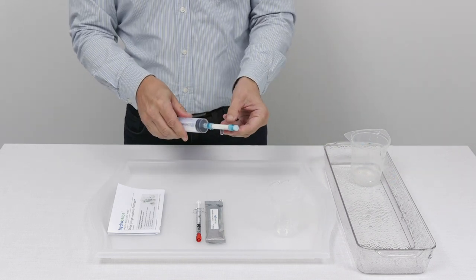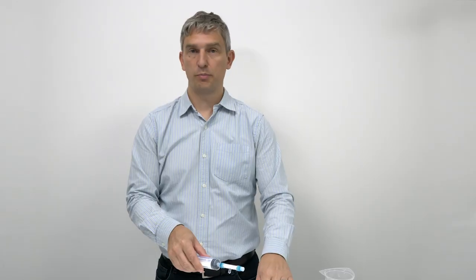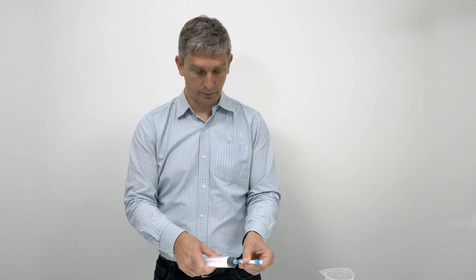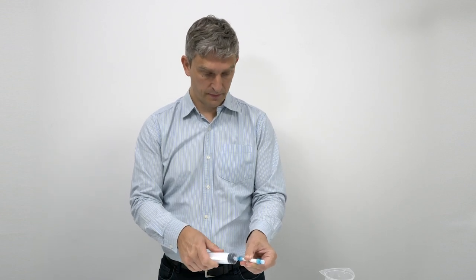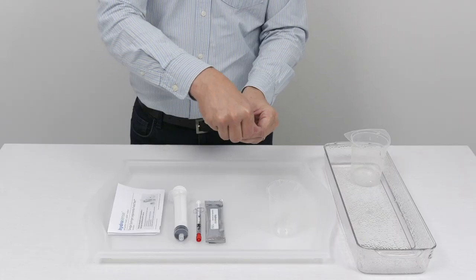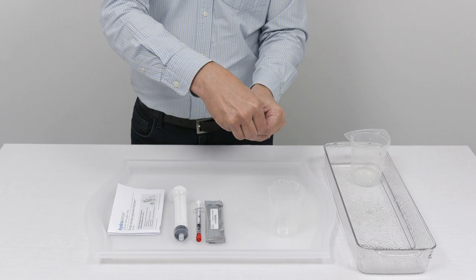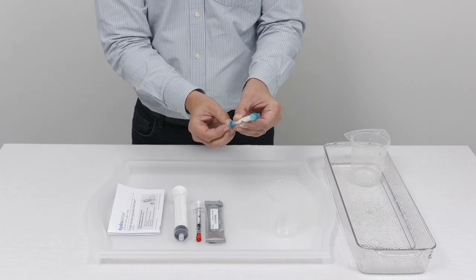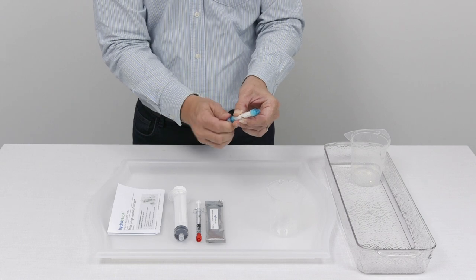So now that we've concentrated any Legionella bacteria that were present in the sample into the filter we need to extract them from the filter. The pressure from the syringe has been pushing the bacteria up to the top end of this filter here so in order to increase the sensitivity of the test we recommend that you remove the cap from the top of the filter and screw it onto the bottom.